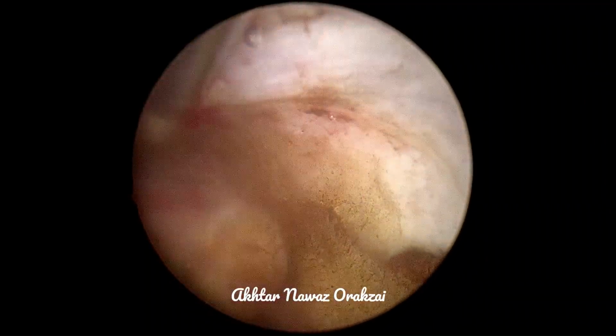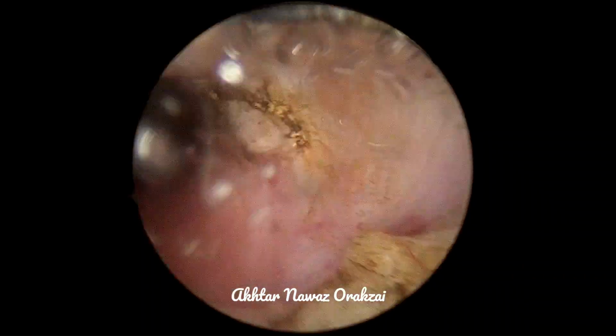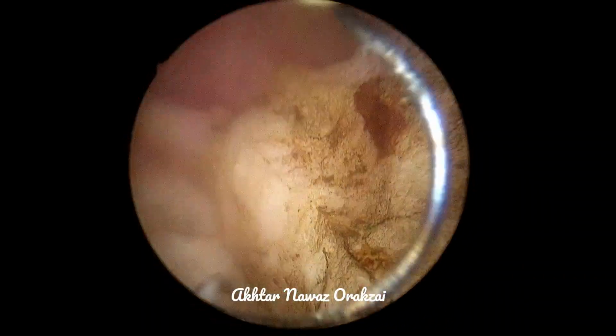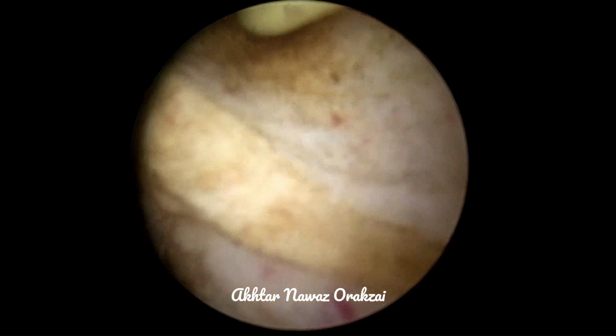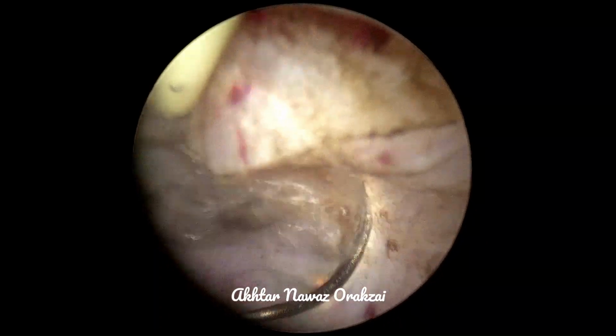So I start at the base of the lateral lobe, and then slowly and gradually I move towards the upper side. I start resecting at the 5 o'clock position, and slowly and gradually I'm moving upwards.